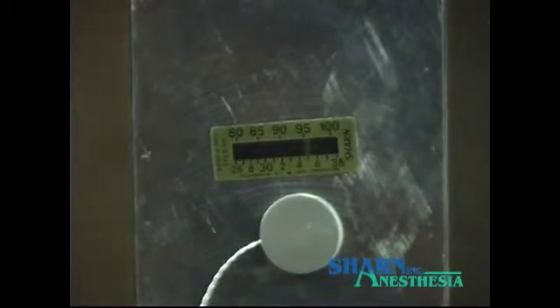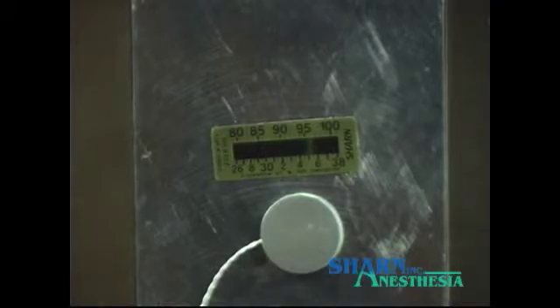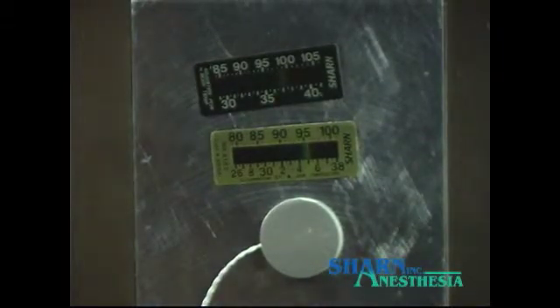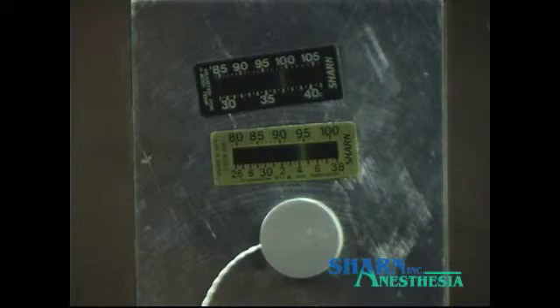Notice the reading on the liquid crystal strip is 94 degrees. This crystalline strip reads the temperature of the forehead but is adjusted to display the equivalent of esophageal core temperature.